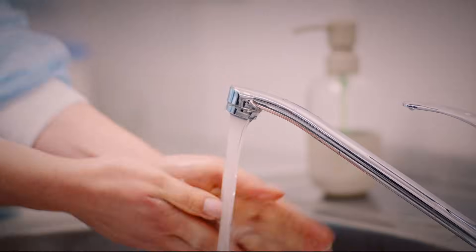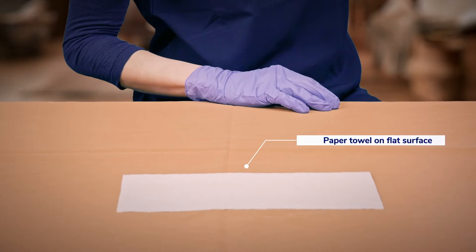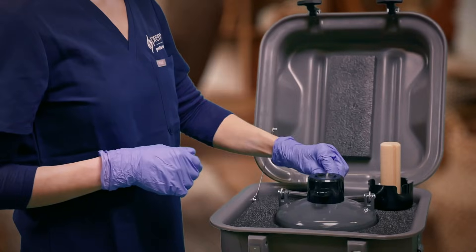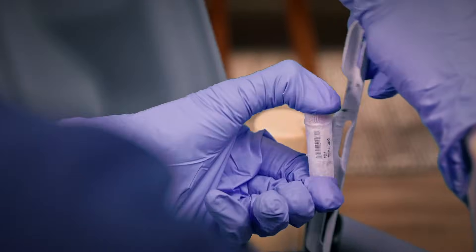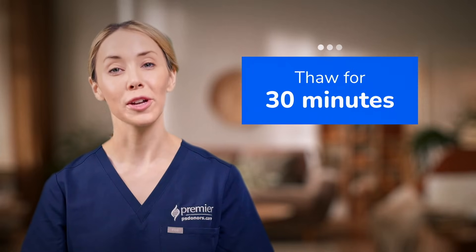First, wash your hands with soap and water. Make sure to avoid soap that contains fragrance. Place a paper towel on a flat surface, such as a tabletop or counter. Next, put on a pair of gloves because the contents of the tank will be extremely cold. Pull up on the metal holder and remove one vial from inside and place it on the paper towel. Let the vial thaw for 30 minutes. Avoid unnecessarily touching the vial, and don't use heat to speed up the process as this will damage the sperm.